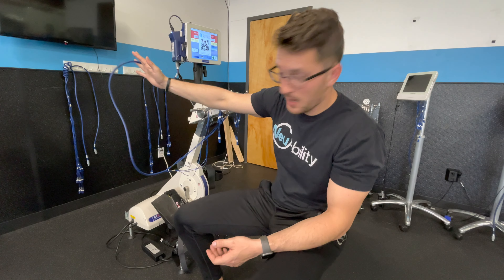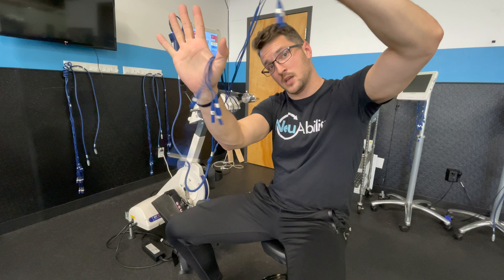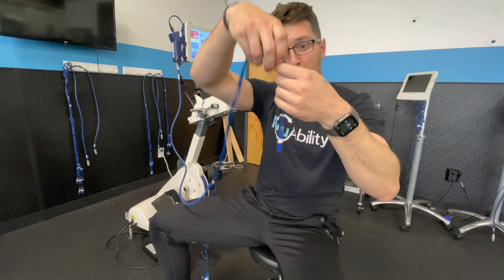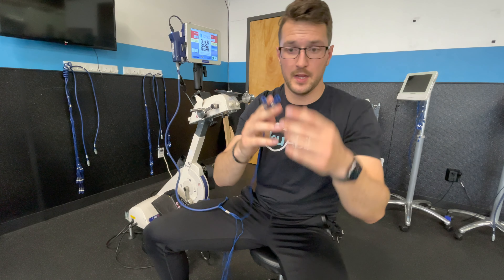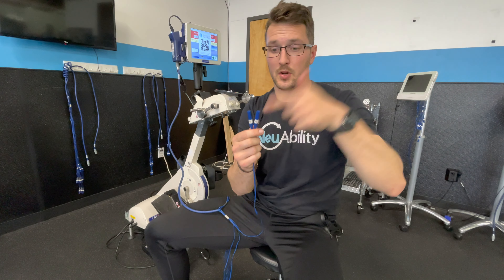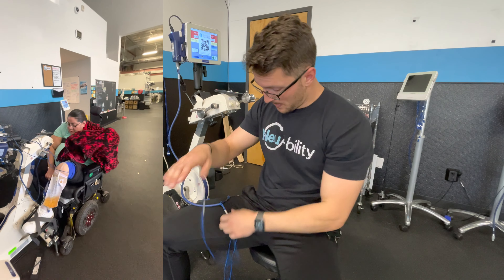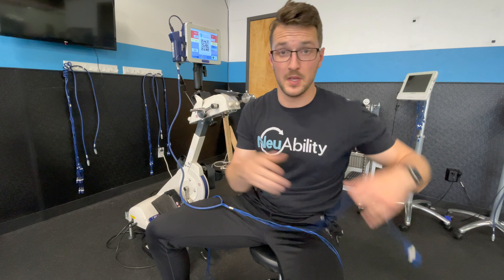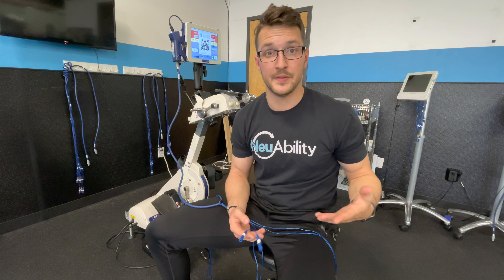Stemming from the blue ergometer box is a blue cable with six lines attached. Each line has two ends and they're labeled one through six, corresponding to specific muscle groups. For example, line three has two ends, allowing stimulation to go in one and out the other, keeping the stimulation correctly contained. Because of this two-line setup, we place two pads on each muscle group — two pads on quadriceps, two on hamstrings, and two on glutes.